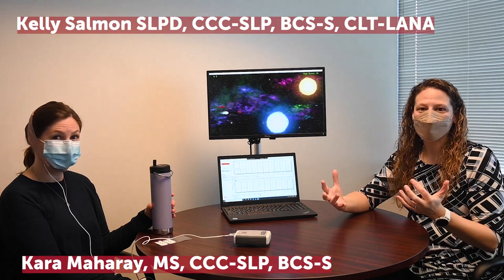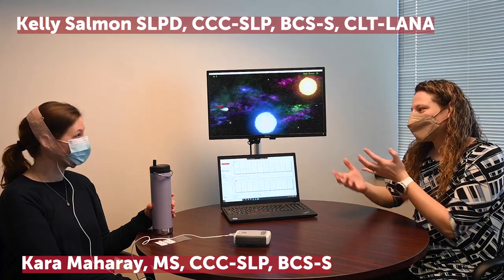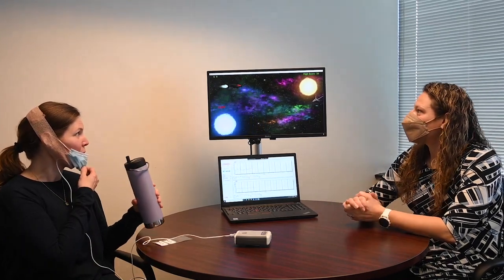Have you ever wondered what your swallowing looks like on a display? Here we have equipment called surface electromyography that will allow you to see your swallow represented in a visual image.